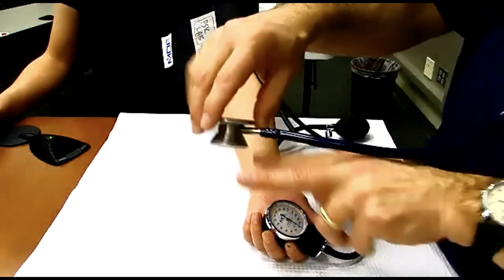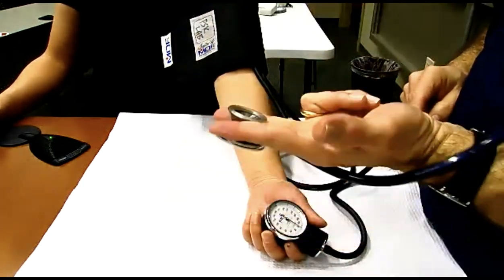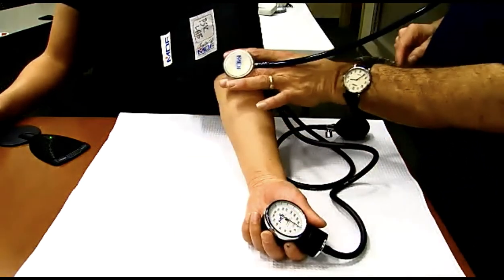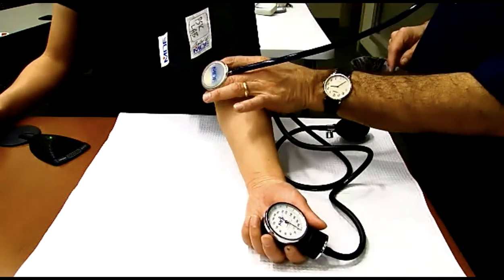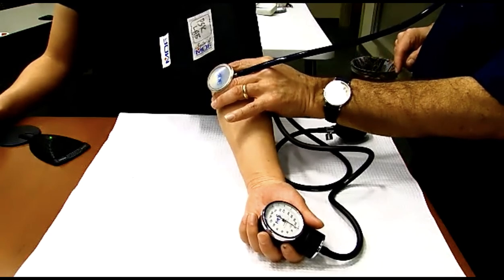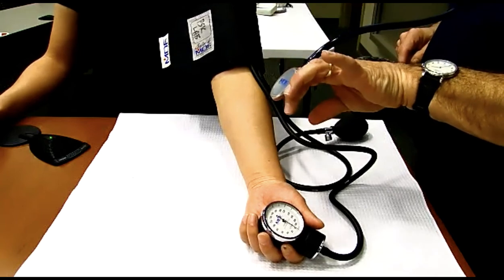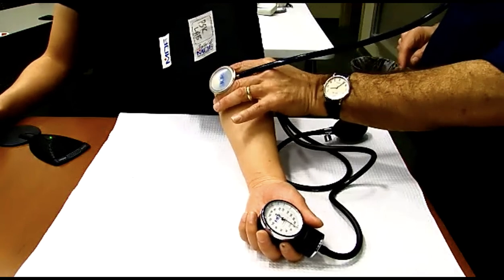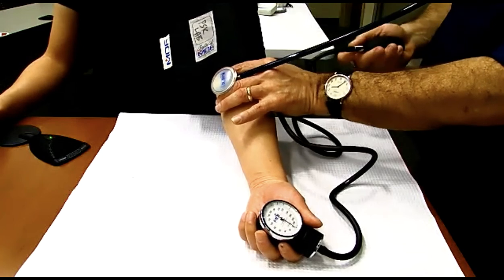I'm going to hold this. Watch this. This is just kind of a helpful tip. Between your index finger and your middle finger, hold it with the tubing on top. So I've got it angled down, but between my fingers, because now watch, I can come over here and put it over, and my thumb goes behind your arm, and I can get a nice firm grip. I can kind of squeeze. I don't have to squeeze hard, but I've got a nice firm grip on it, and it's comfortable. So I'm going to put that right over there. Squeeze it nice and firm, so it's just on there nice and flat. Then in my dominant hand, I've got my bulb valve and I can see the pressure gauge. And at this point I can hear.